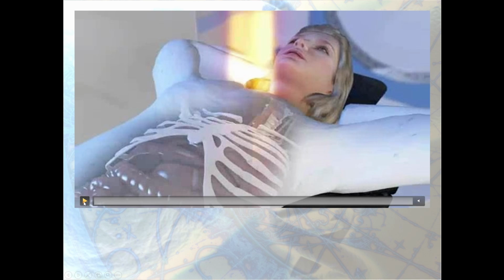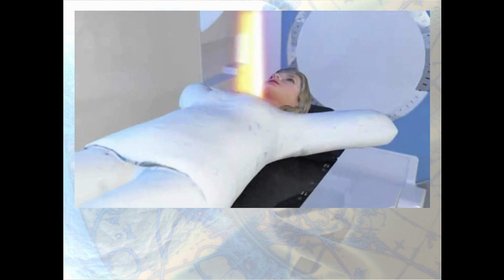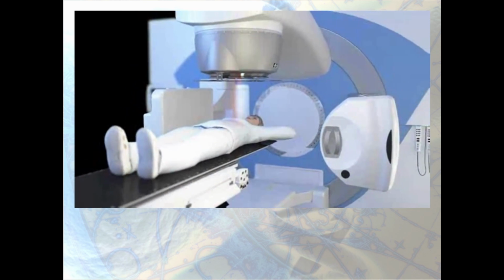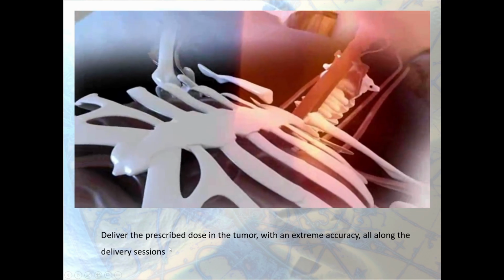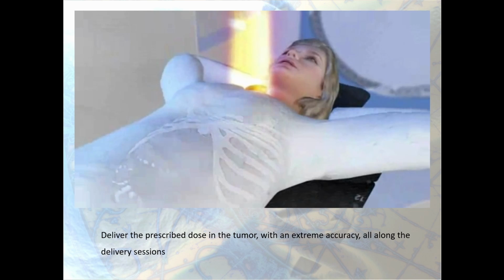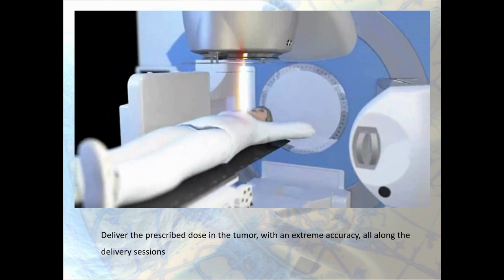Let's see what it looks like. There is a person here, and a beam will be sent into the body. So you see, well, X-rays are not yellow, but you see a beam coming out of the LINAC head, and you need, every 2 days, to deliver the prescribed dose into the tumor exactly at the same location to be sure to target properly the tumor.